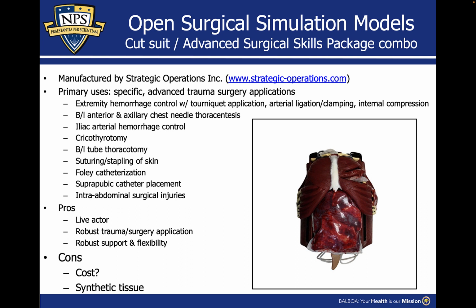And admittedly, I was not able to get the costs for any of these models, but I can't imagine this is a very inexpensive model as compared to the TraumaMan. However, it is much more robust in what it is able to train.